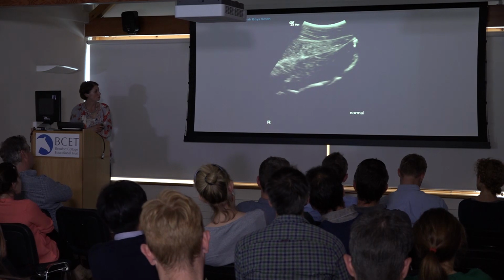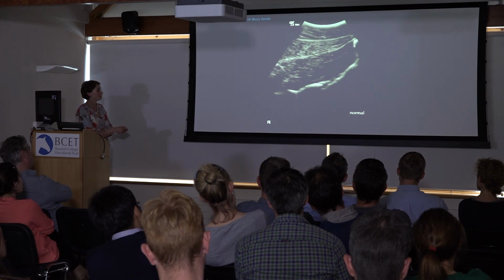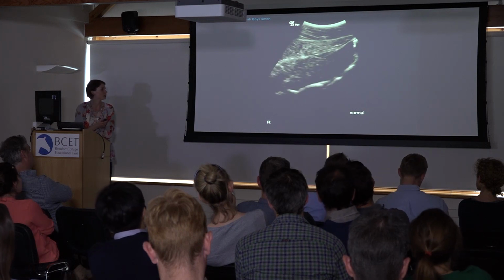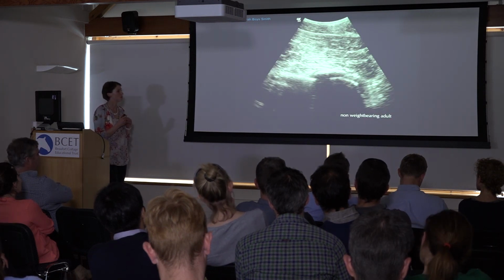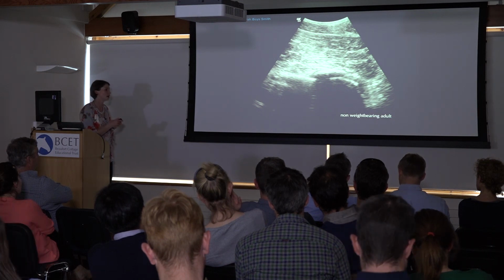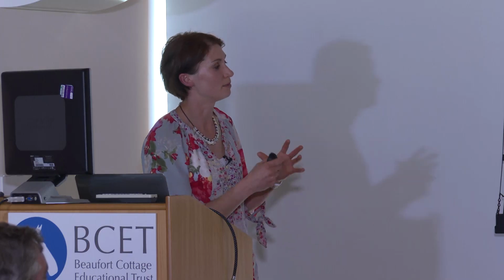And again in longitudinal, this is our joint capsule here, femoral head here, acetabulum here, and then that's our trochanter way up here. So as with any joint, you want to see nice, smooth, bony surfaces, no irregularity. It is important for adult horses to be weight-bearing when you assess them. It's quite easy sometimes to be concentrating so hard on scanning that the horse suddenly rests their leg and you don't quite notice it. And that can then affect what you see ultrasonographically. That'll move your acetabulum relative to the position of your femoral head. So it's important just to keep an eye out for that.